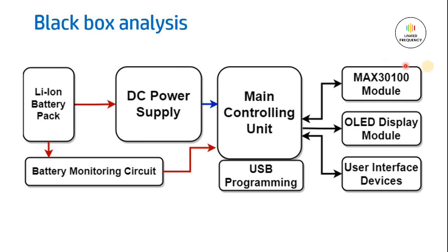Thereafter, we have a MAX30100 module, which is a heart rate sensor module, which includes SpO2 sensing as well. This module is interfaced with the main controlling unit, and then the data will be displayed on the OLED display. This OLED display module is available in a variety of sizes and interfaces in the market. However, we are using an I2C based 0.96 inch OLED module, just easy for our development activity.